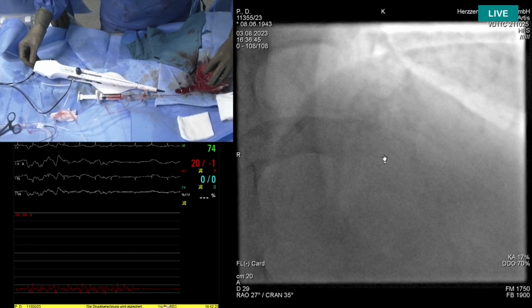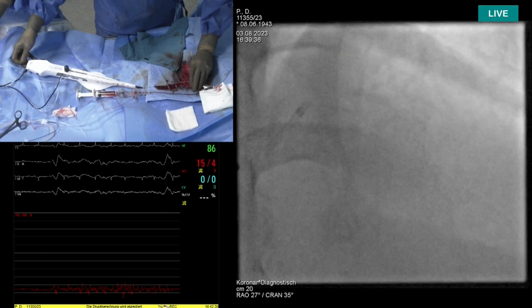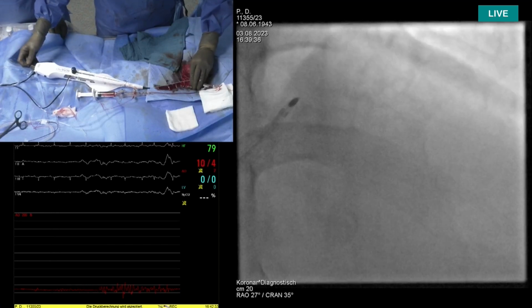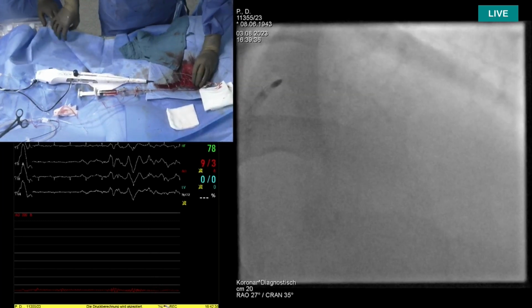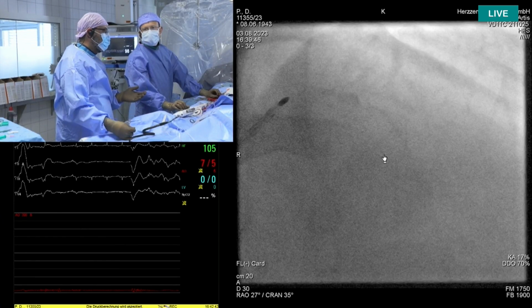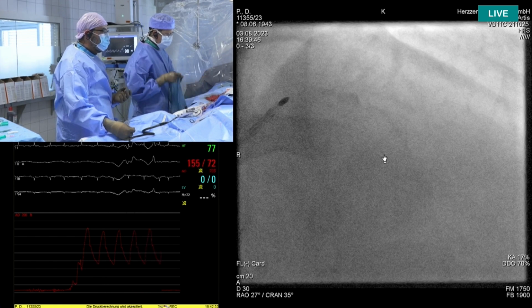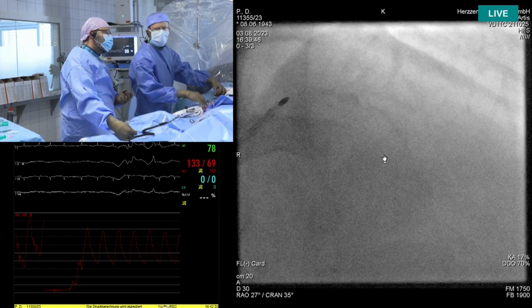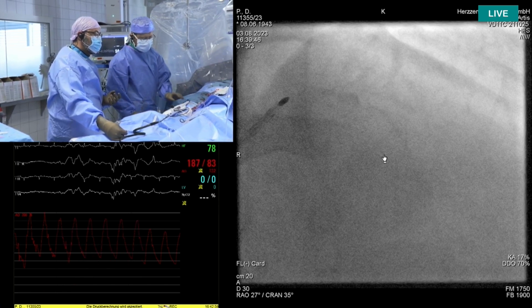And how often do you use a cutting balloon or something like this, especially for big vessels after rotablator when you are doing left main or big LADs? So not routinely, to tell you the truth, are we using cutting balloons together with rotational atherectomy, despite the fact that we have good data from Protected Combo, which is a good registry that has shown that, at least compared to a historical control group, you may obtain more lumen with a combination of rotational atherectomy and cutting balloons.